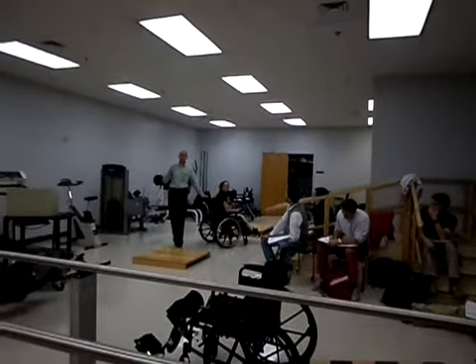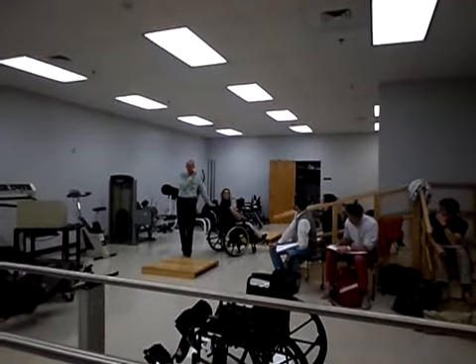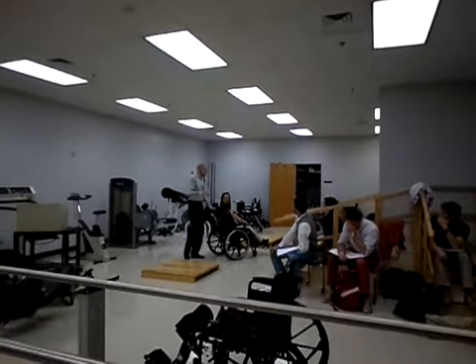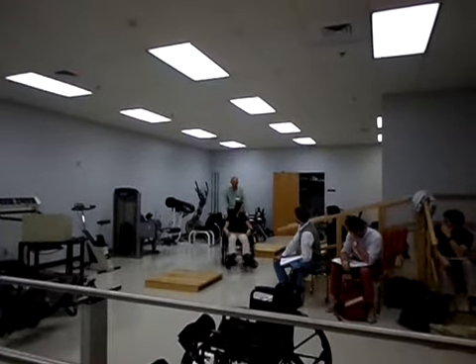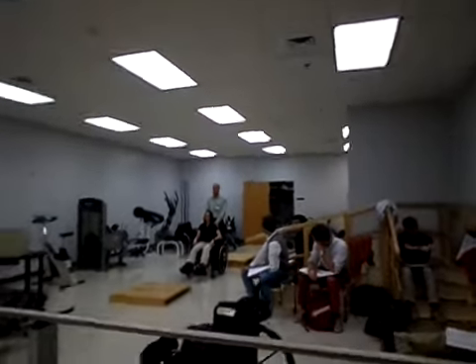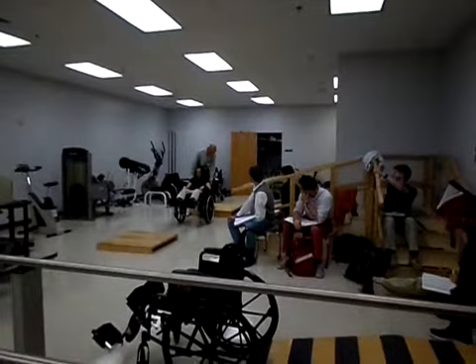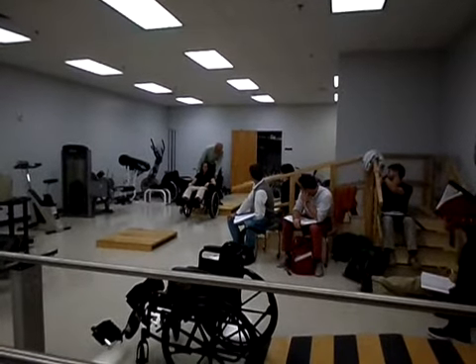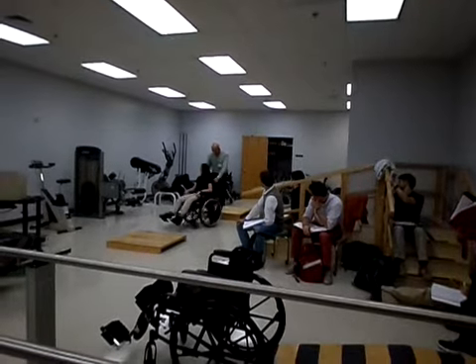Now we're going to show the more difficult way, because that's what we're going to do when we go up and down the stairs. All right, so we're going to go up the curve backwards. I don't put anti-tippers on. We'll see if they're in the way. I'll tip you backwards. So I've got to tip her backwards first, and then I'm going to come right up to the step, and the tipping bars are in the way, so I'm going to take them off.